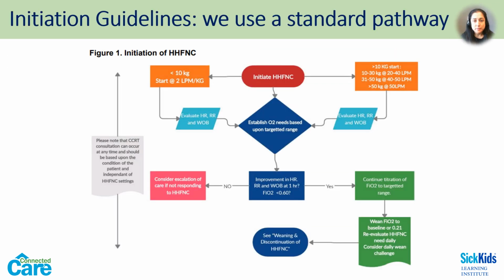What is now going to be presented are SickKids heated high flow nasal cannula pathways that we use throughout our organization. We would start our policy in terms of flow rates and what we would do with our high flow nasal cannula interface. So this is specific to high flow nasal cannula.